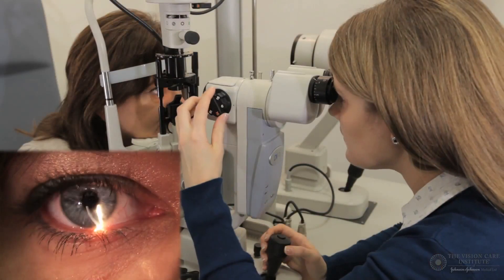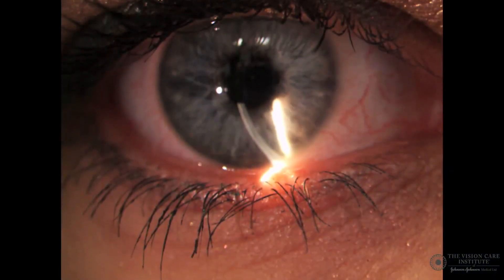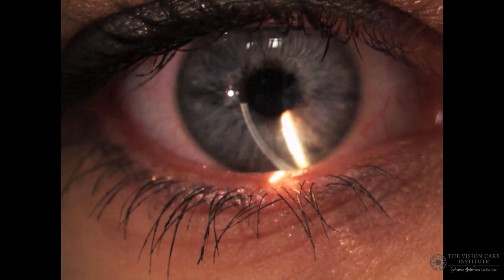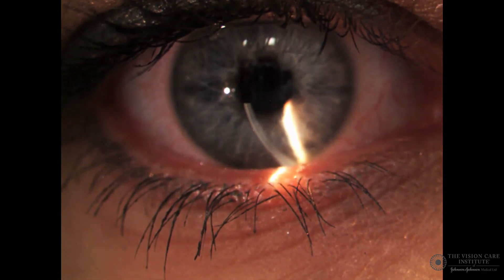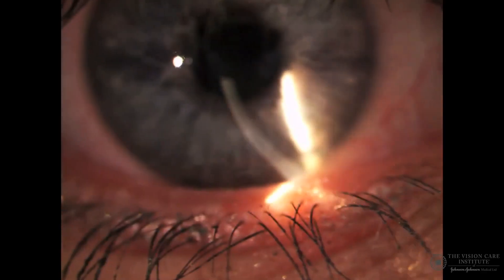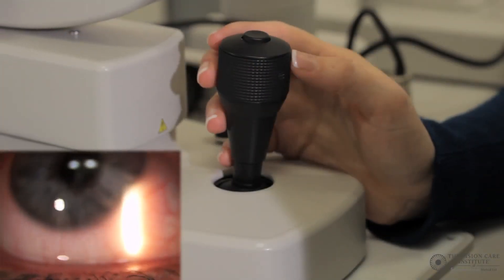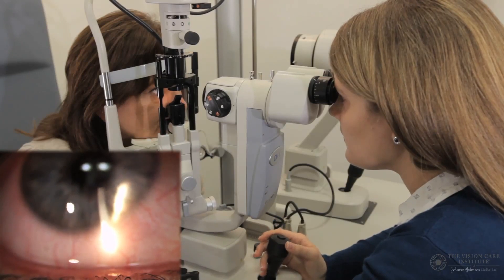We can magnify the image and get the patient to look straight ahead initially, and then make the two beams form a V-like shape. We can then get the patient to look upwards and try to focus the slit lamp on the structures on the cornea above the beam on the right.